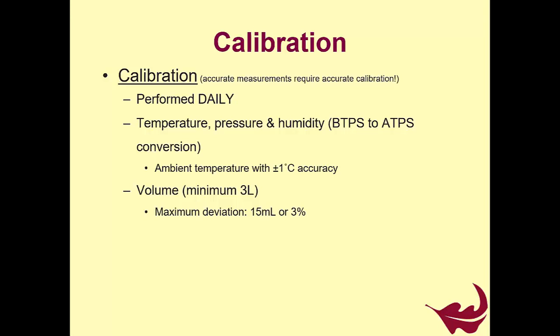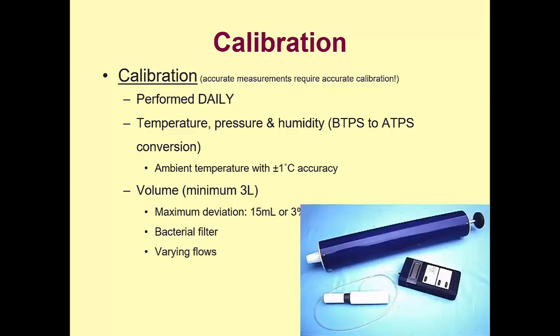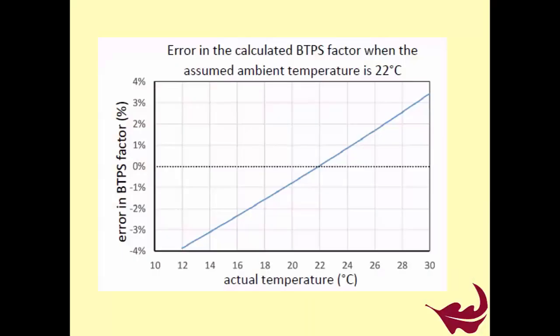So just have a look. This is now 15 mils or 3%. And obviously you use the bacterial filter like you would during the testing, and you do it at various flows, just the same as we've done previously.